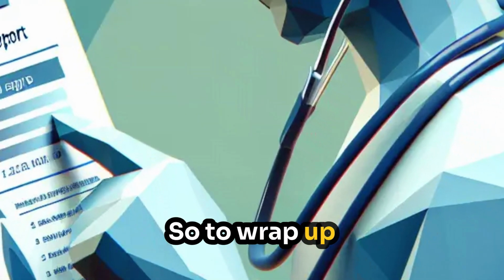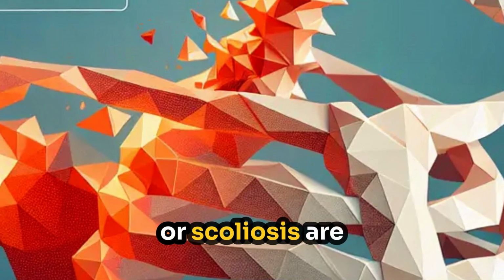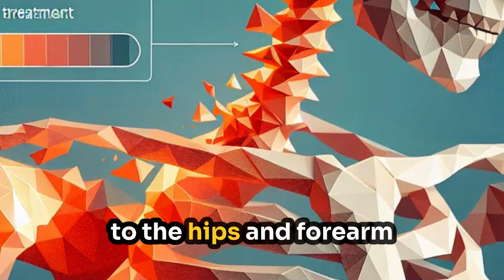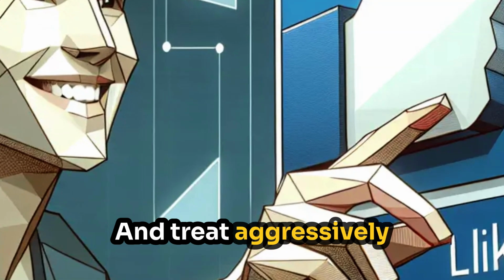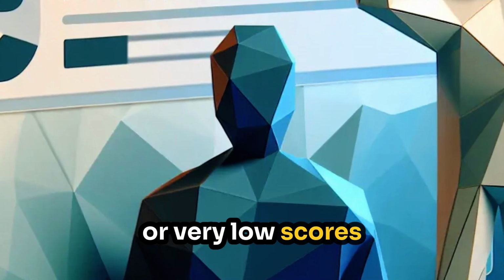So to wrap up, know your T-scores and Z-scores. Always ask if arthritis or scoliosis are affecting the results. Pay special attention to the hips and forearm. Focus on the lowest T-score. Ignore the Ward area and treat aggressively when needed, especially after fragility fractures or very low scores.